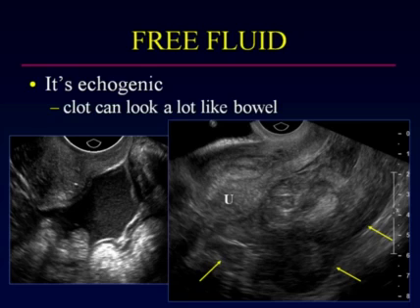So what we recommend is that you start by looking at the bladder. You adjust your gain just so that you start to see some artifactual echoes, then you back off from the gain until the fluid is anechoic, and at that point you know your gain settings are correct and you don't adjust them as you examine the rest of the pelvis. Another thing that you can try is to have the patient roll, or to actually poke the fluid with a transducer, and if those particles are real and not artifactual, they will move as you have the patient move or as you poke them with the transducer.